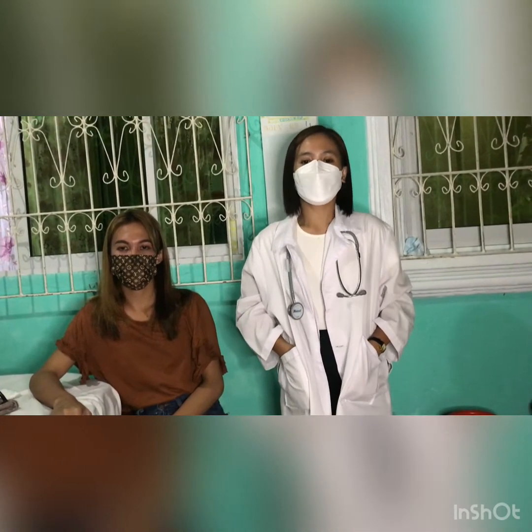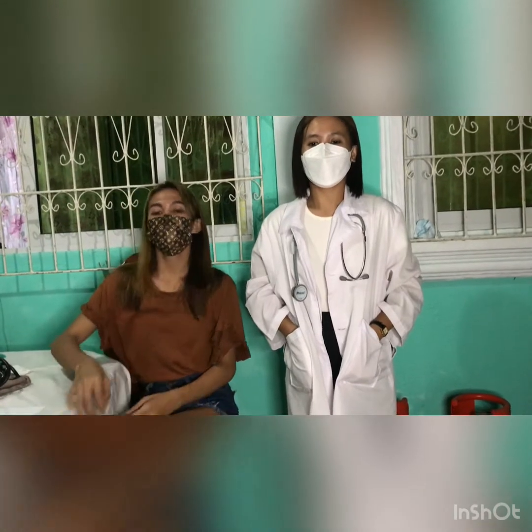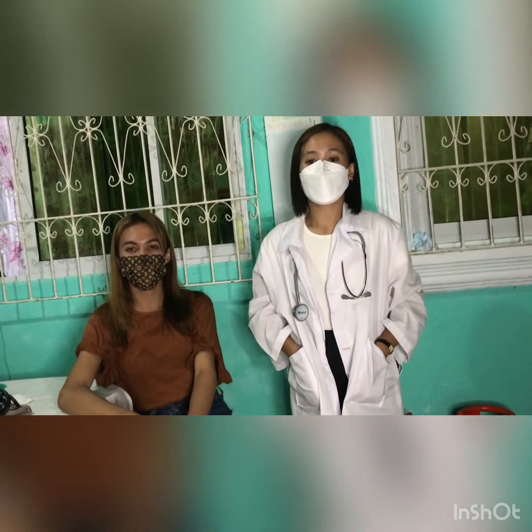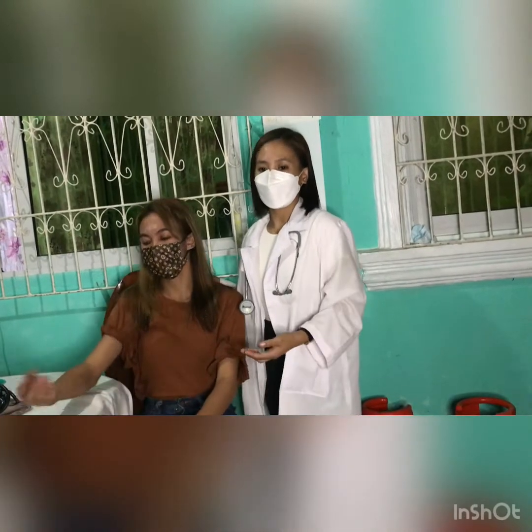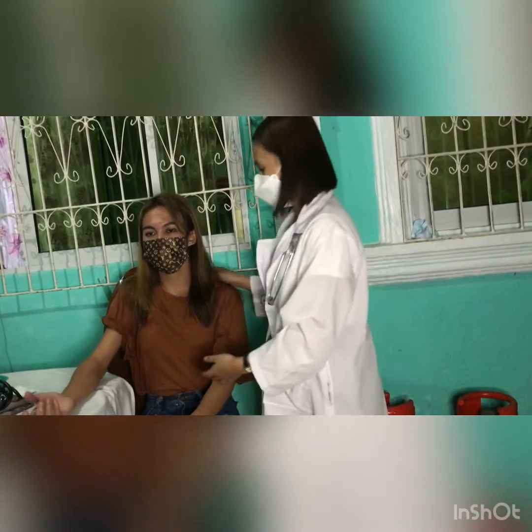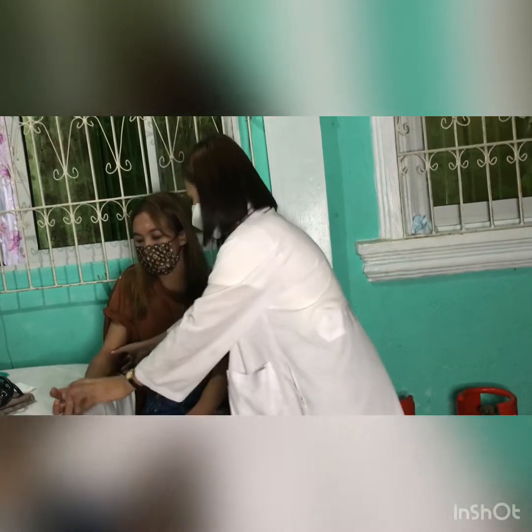So first, position the client appropriately and allow 10 to 15 minutes of rest if the patient was engaged in strenuous activity before the BP assessment. Use a lying position, or a sitting position with arms at the side, palm facing up, or with arms slightly flexed, the forearm supported at heart level and facing up. Then, fold the patient's shirt, sleeves, or gown up to the shoulder, making sure it is secured and will not fall to the brachial area.